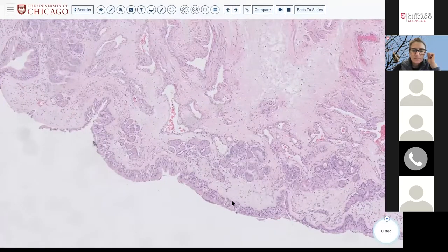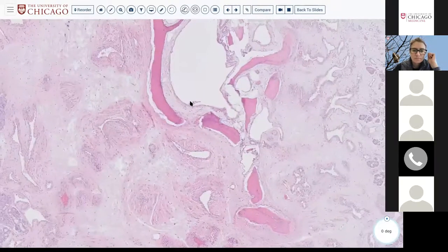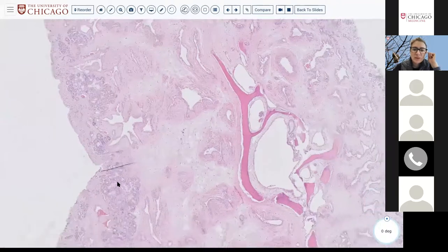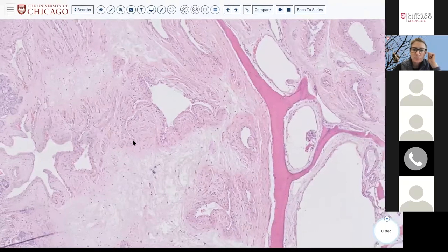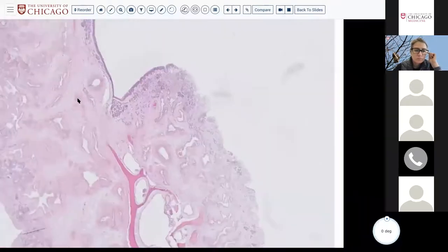This is respiratory, and we have bone. So it's maybe sinus, nasal sinus. Okay, and what's between the respiratory and the bone? This is blood vessels maybe here, and then we have epithelium with a stroma.